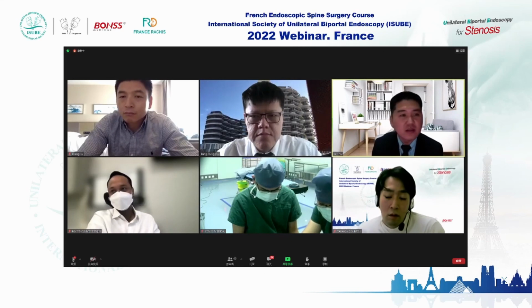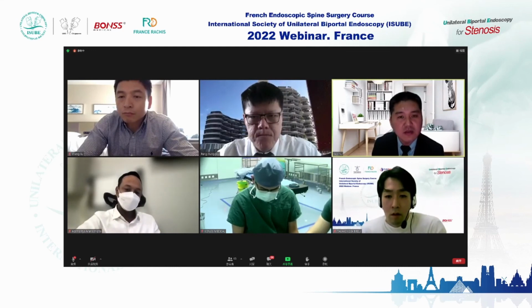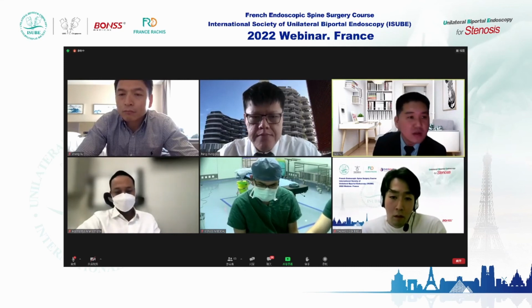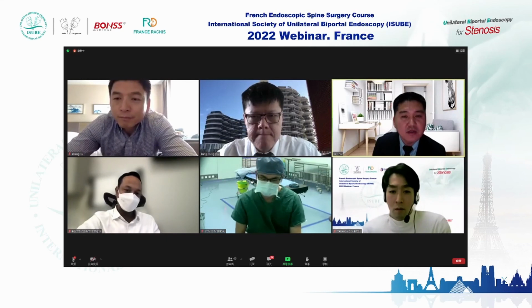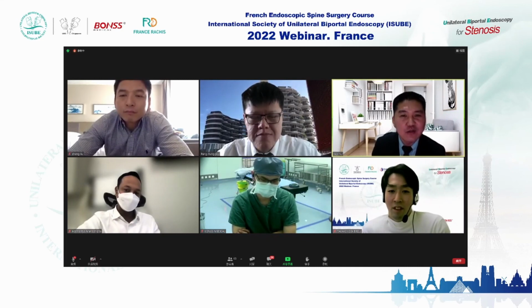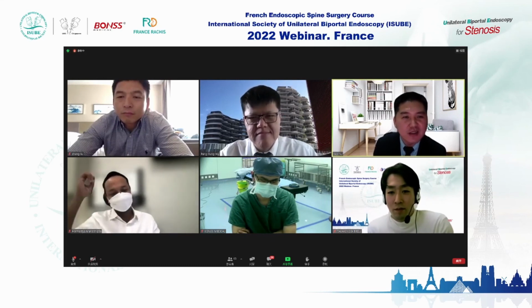Thank you to all the guests. I think biportal endoscopic surgery makes endoscopic spine surgery easier compared to the monoportal, and you need to go step by step. First, maybe discectomy. Dr. Yoshimizu said endoscopic spinal fusion is easier for him, but most of us start with discectomy.